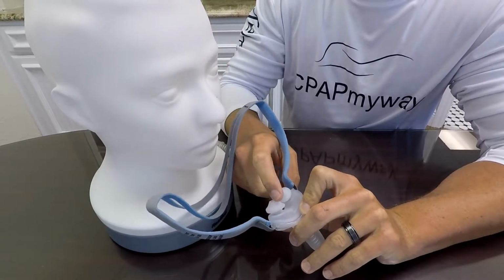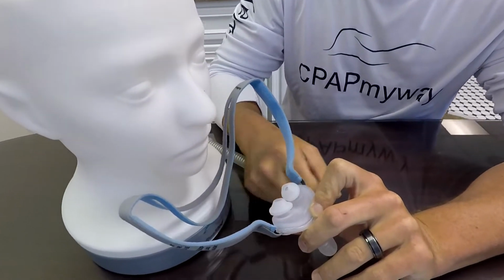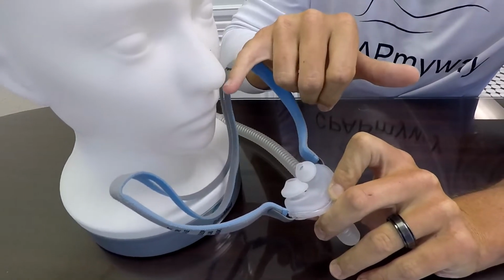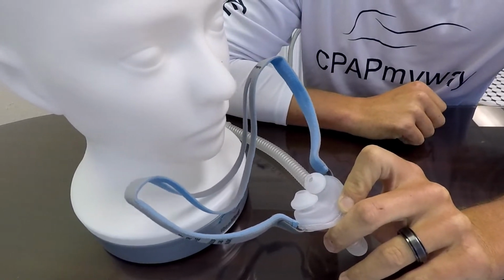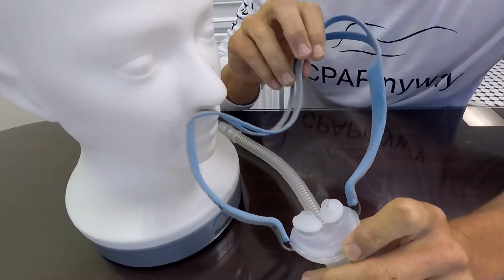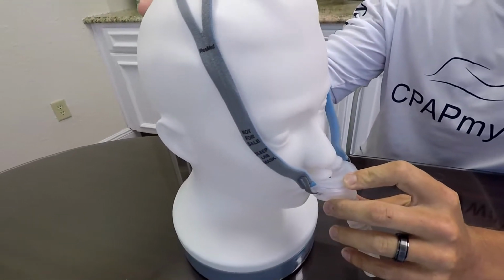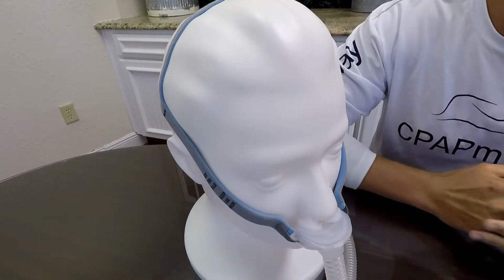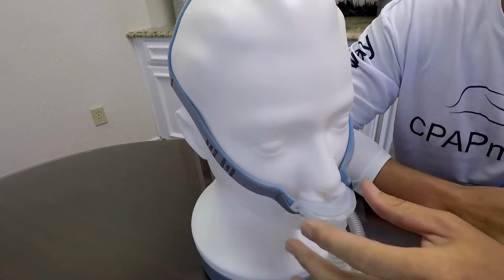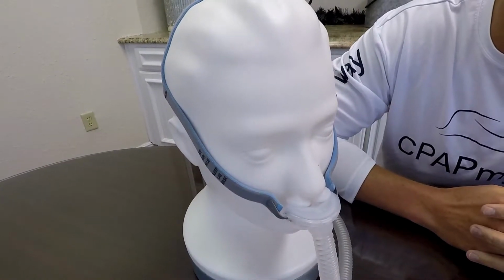Most of them seal around the nostril itself, which does provide very minimal contact with you, but that is also the only contact, so sometimes there's a little bit of pressure related issues on the nostrils. Overall, it's really great for people looking for something more minimal, or maybe somebody who has a little bit of a claustrophobic feeling. It's ideal for people on moderate to low pressures. Higher pressures can be a little bit difficult, I should say, exhaling through those little nasal buds.